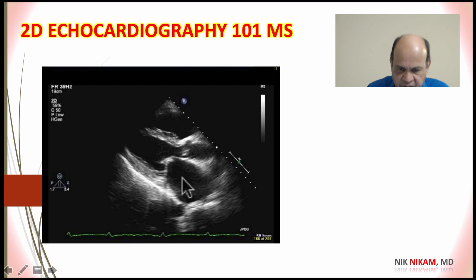And here's another example of increased echoes coming from the aortic valve, and there's also some increased thickness of the leaflets. Whenever there is increased thickness of the leaflets or some fluffy structures sitting on top of the valve, you always worry about possible vegetations from infective endocarditis. And this is the left ventricle, and here we have the aorta and the left atrium.